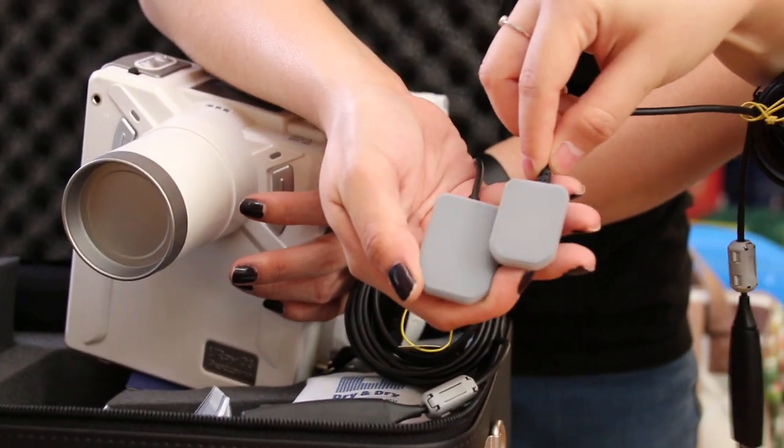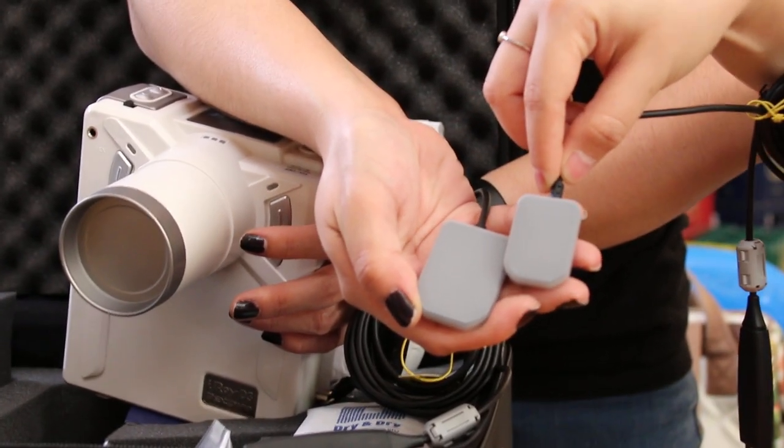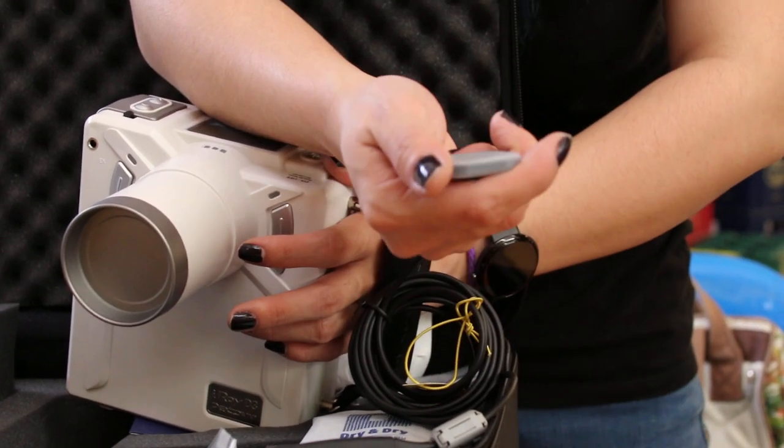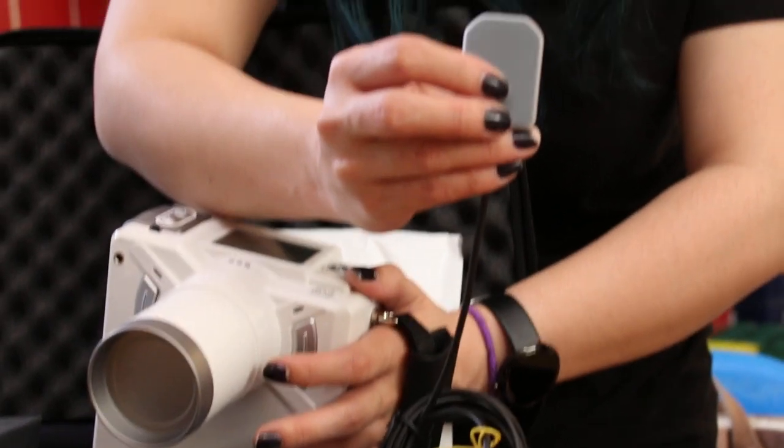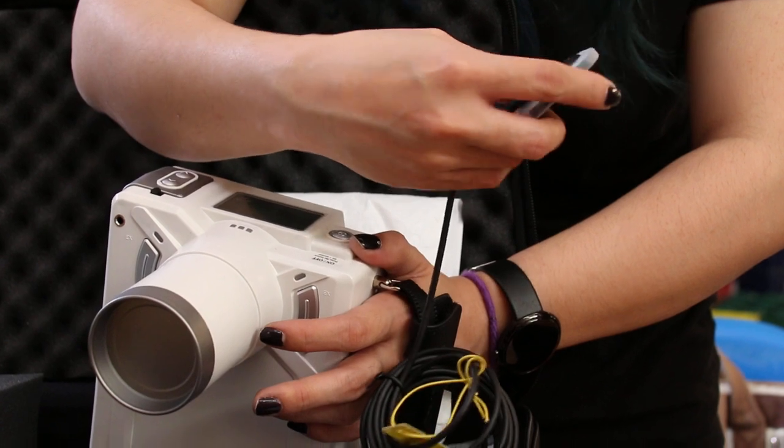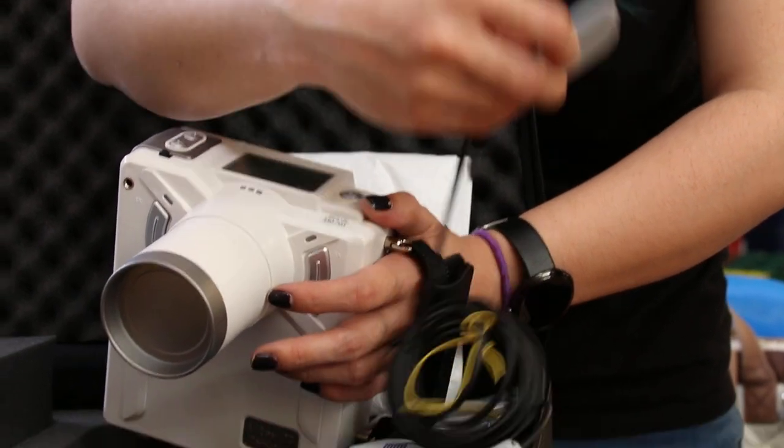So one is for rabbit and guinea pig or hamster, the other one is for cat and dog. But I think the dog is too small because they have the big dog, German Shepherd. Then you take individual teeth. Upper row.